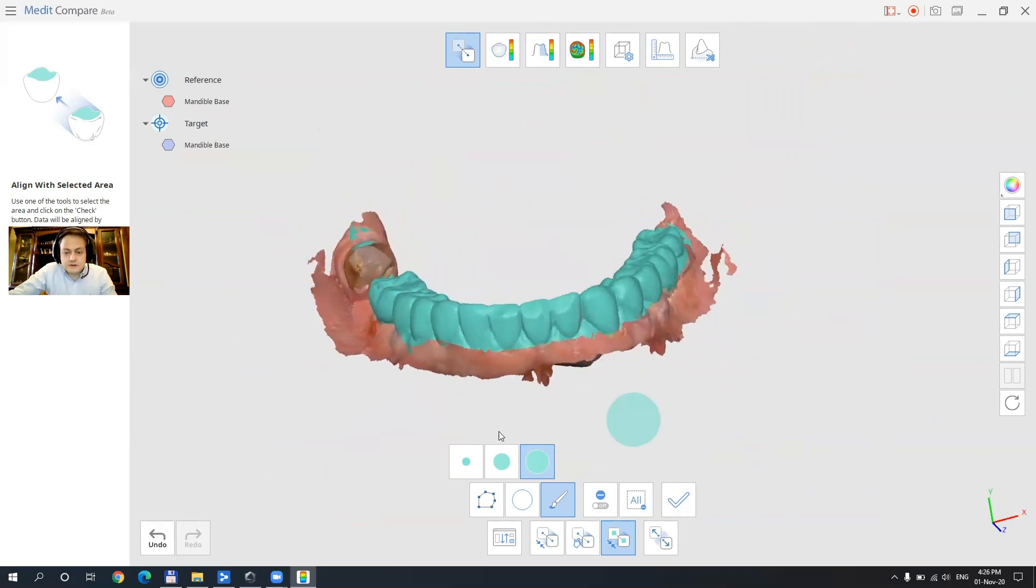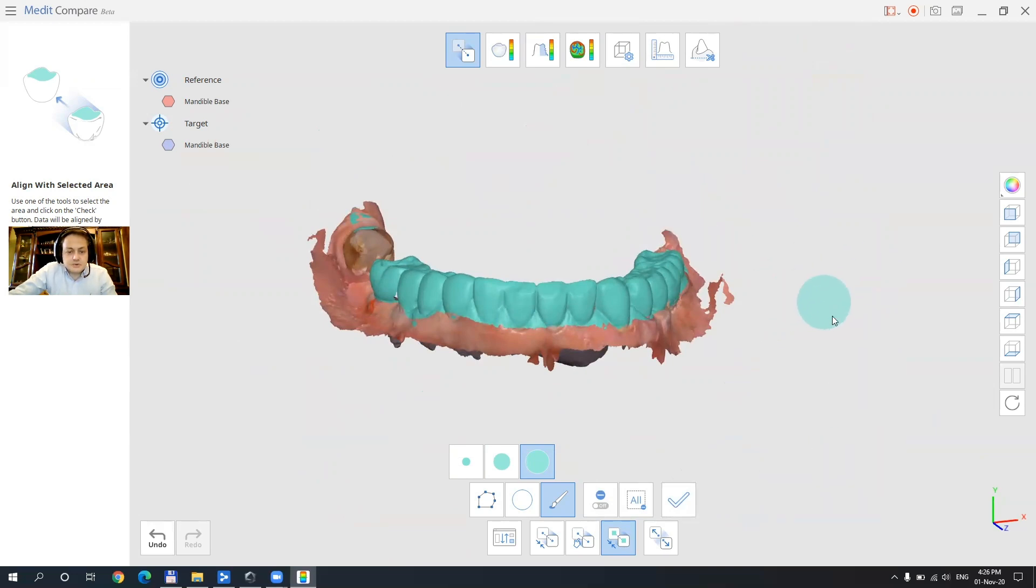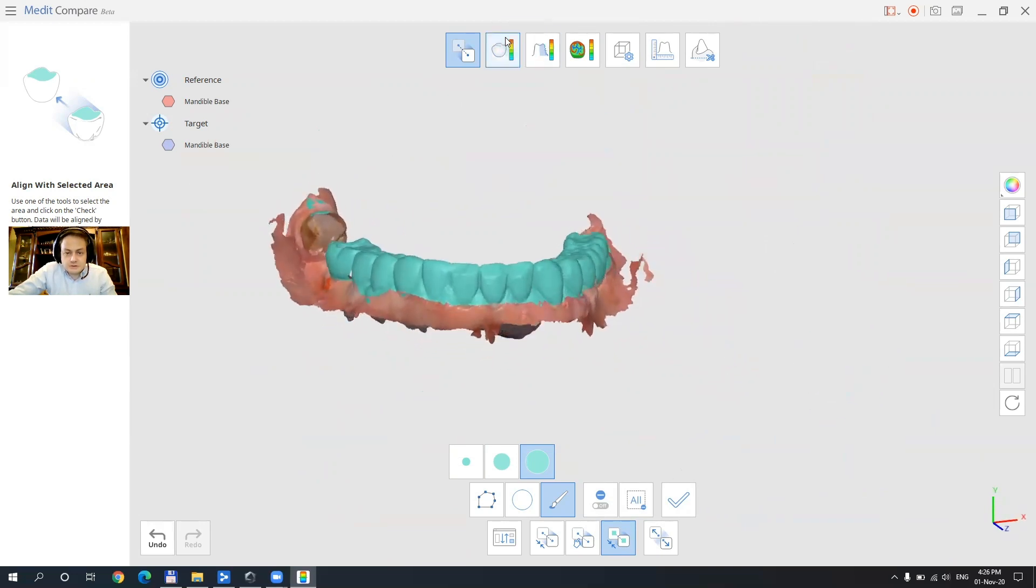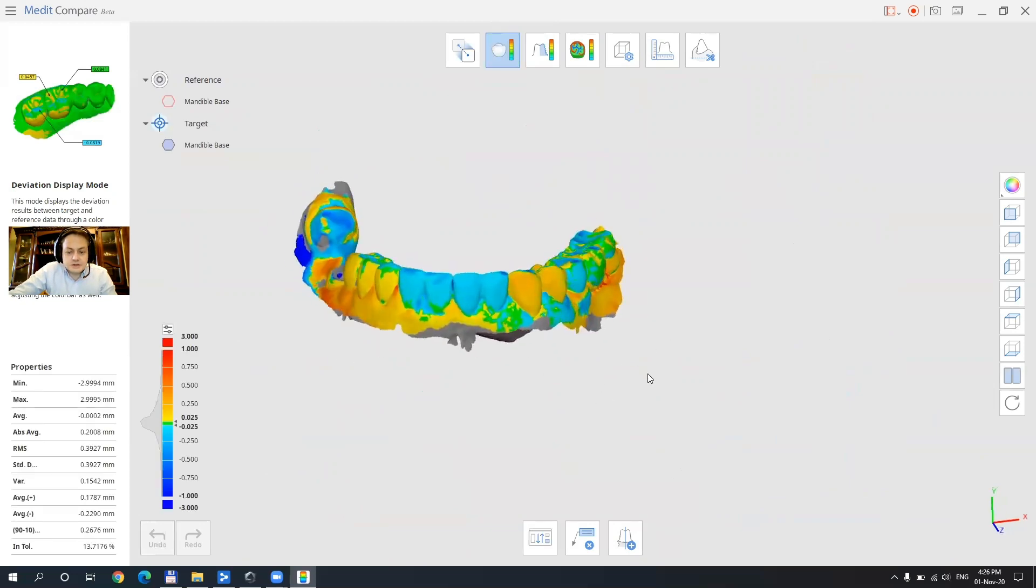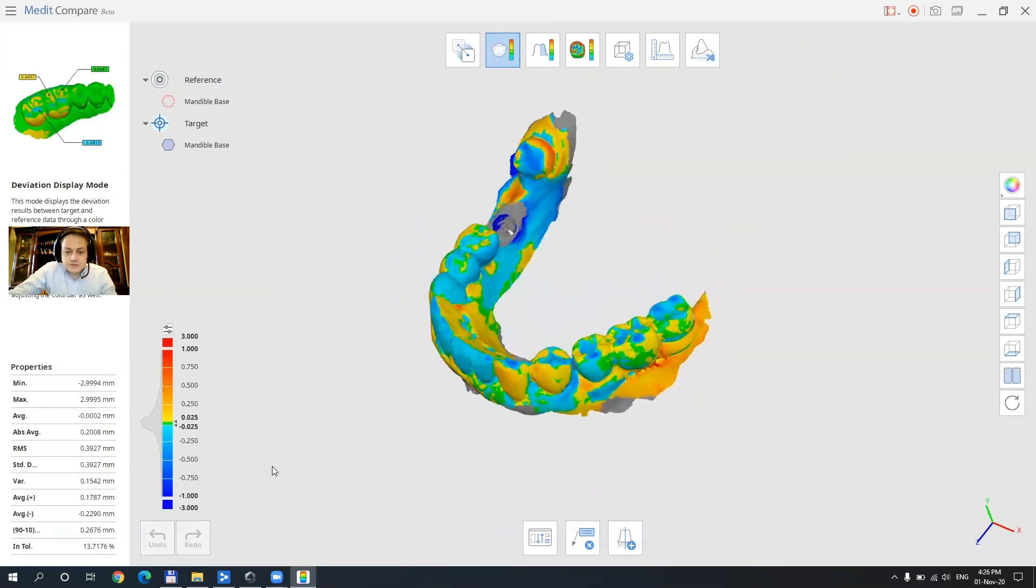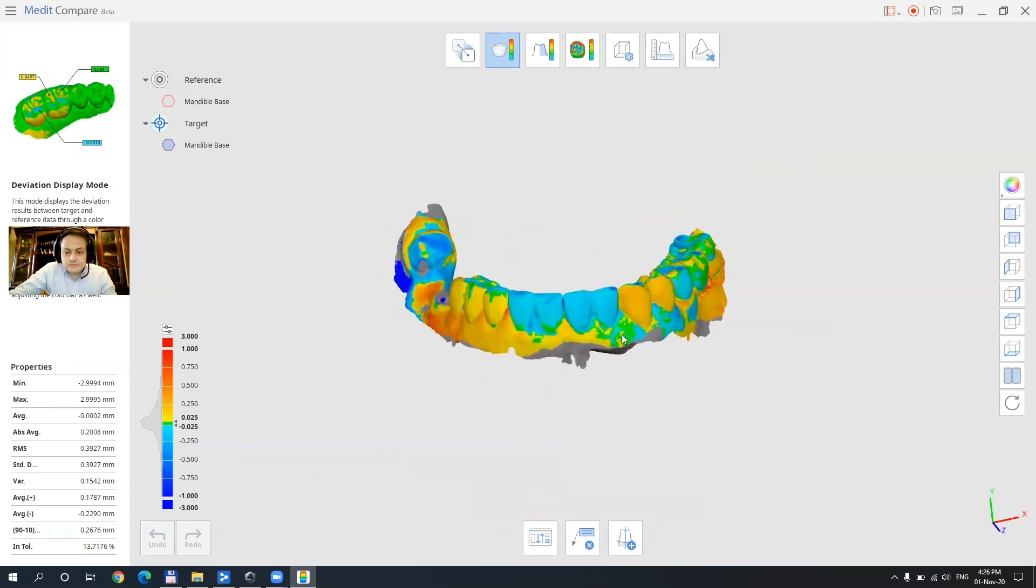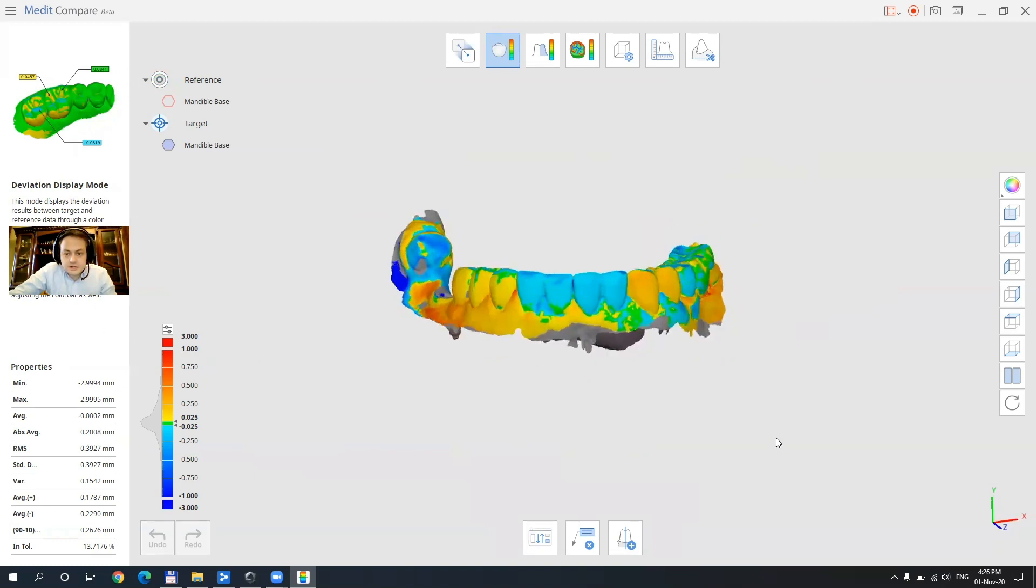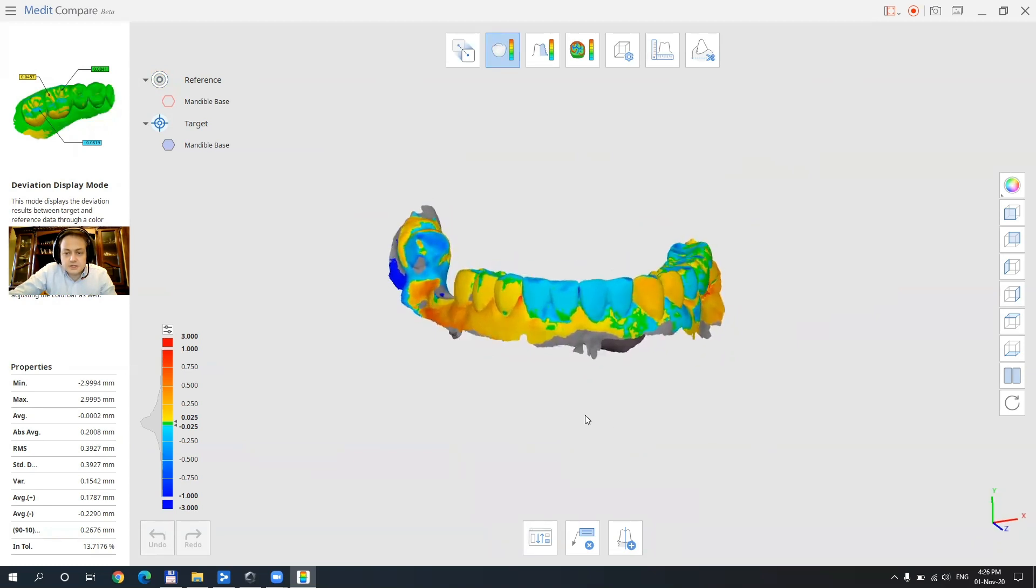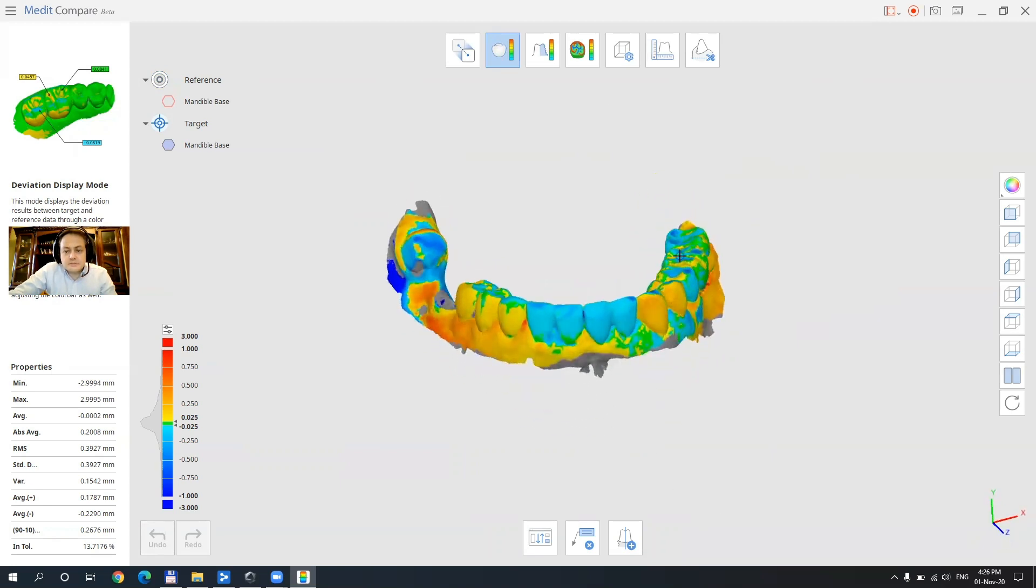So with these three functions out of the way let's just see how the arch got modified during time. This is a provisional that got abraised and we'll see how much this happened. Here we will see that the arches are colored and we have a deviation display mode where we can see how well those two fit together and also how much they modified.